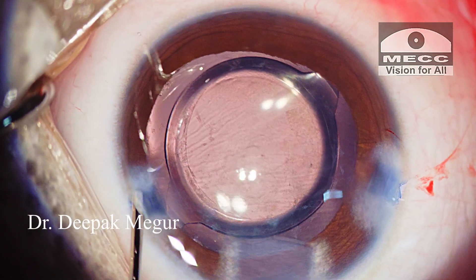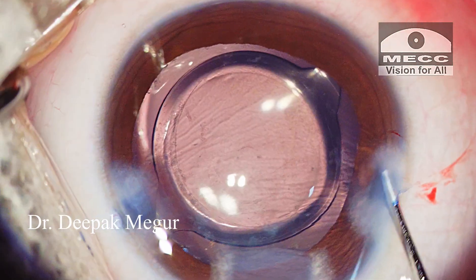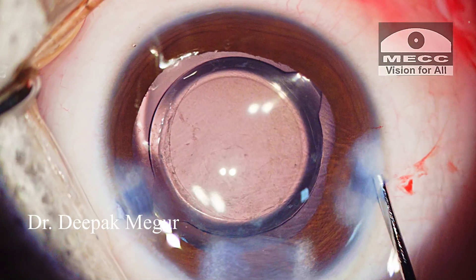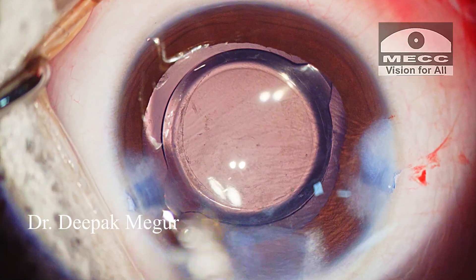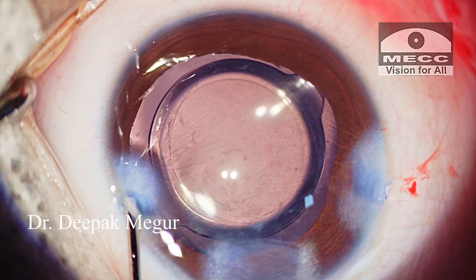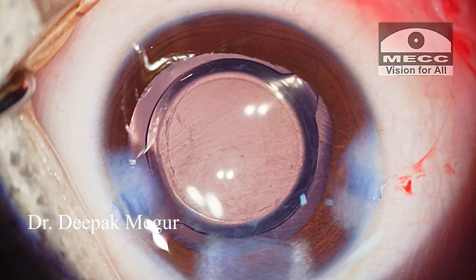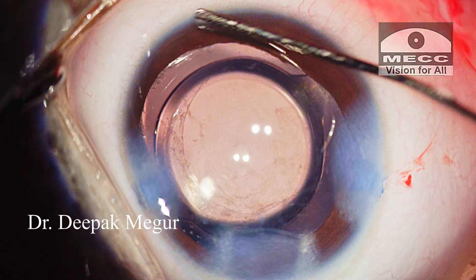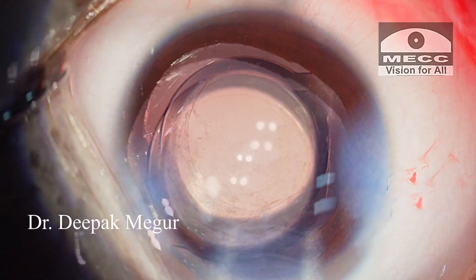That's it — it's time to close now. Stromal hydration is done for sealing the wounds. In children, we need to understand that the tissues are a little bit elastic. Hence, I spend sufficient time to redo stromal hydration a couple of times until I am confident that the wound is watertight.